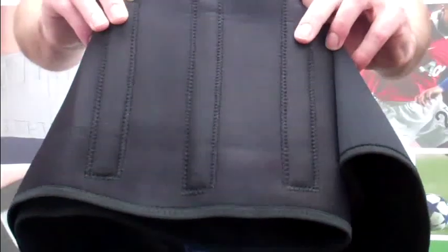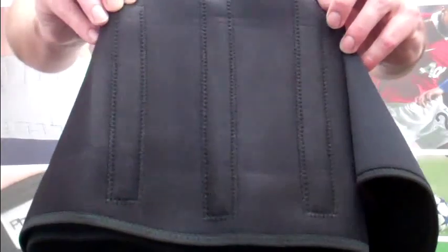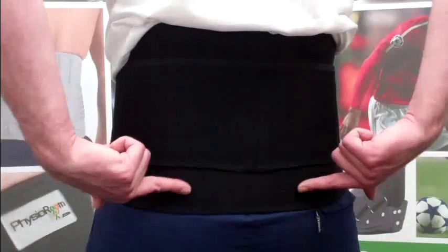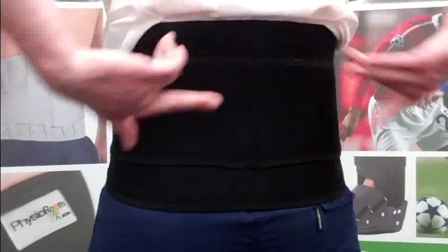Metal stays are used to encourage better posture and restrict movement to aid the healing process of slipped disc, degenerative disc disease and sciatica. The Elite Back Support is made from neoprene to provide heat and ease of back pain and muscle spasms, as well as lower back pain brought on by herniated disc and spinal stenosis.